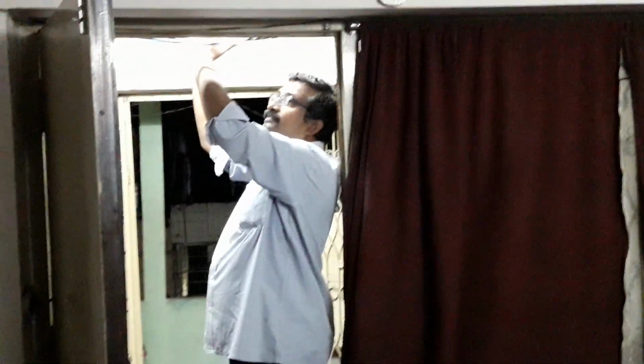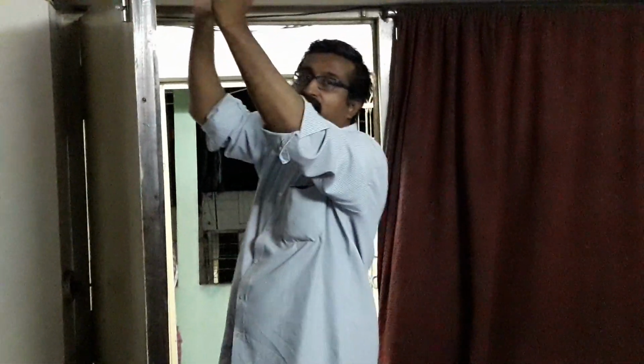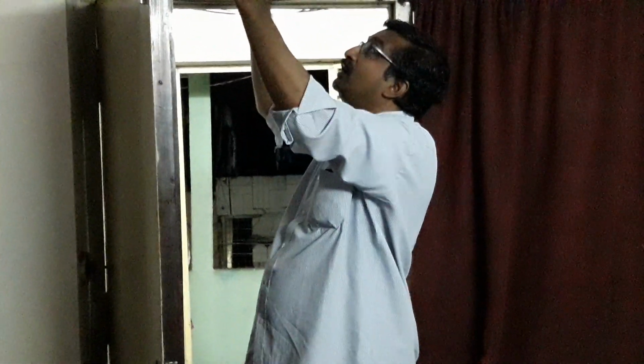So I am repeating again, this upper attachment of the anterior wall of the bulla is a very important landmark. If you work in front of this, it is the frontal recess. If you work behind this, you have to be very careful whether you are injuring the anterior ethmoidal artery or not.